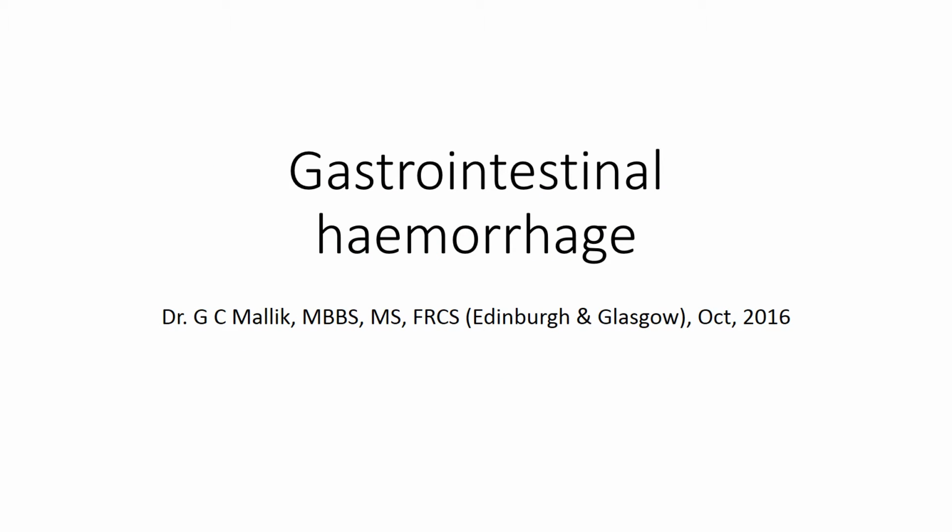The only lecture I'm going to signpost to today is Dr. Malik's gastrointestinal hemorrhage lecture. Dr. Malik goes into all kinds of different causes for gastrointestinal hemorrhage. We're not going to worry about the causes in this particular lecture. This is to tell you how we diagnose gastrointestinal bleeding and how we can treat it utilizing radiologic techniques. So we'll let Dr. Malik deal with all that, the causes, the etiologies of gastrointestinal bleeding.